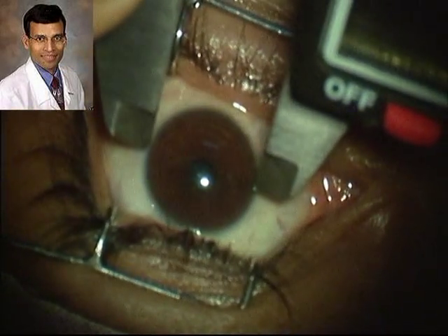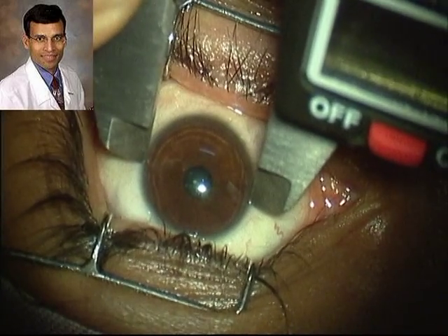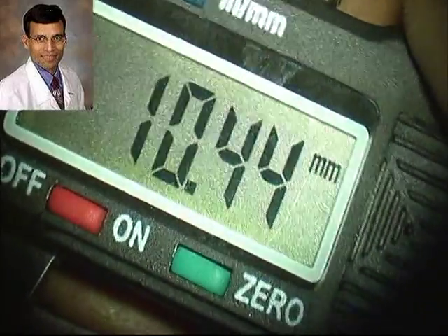This is the procedure of measuring the white-to-white horizontal diameter. We use calipers, preferably digital calipers, with the patient in the supine position under a microscope, and topical anesthesia is used.